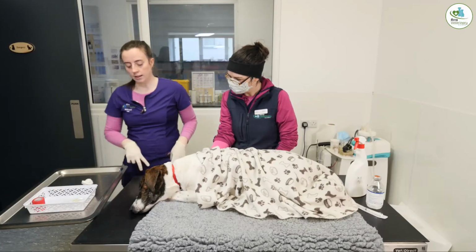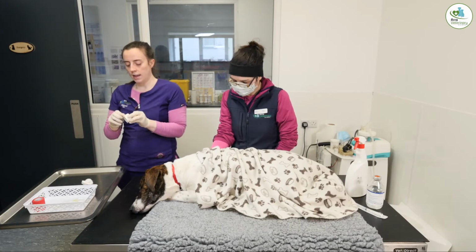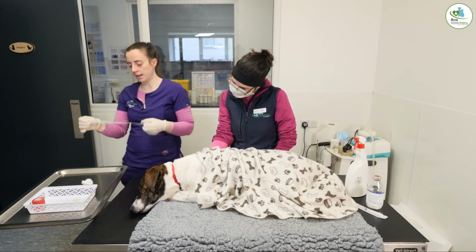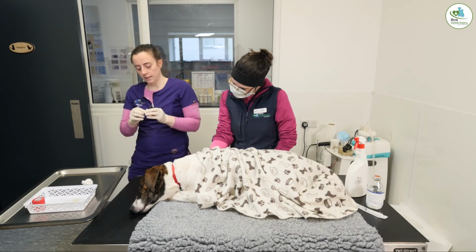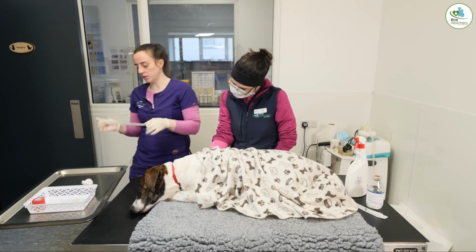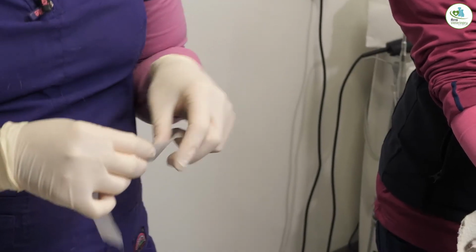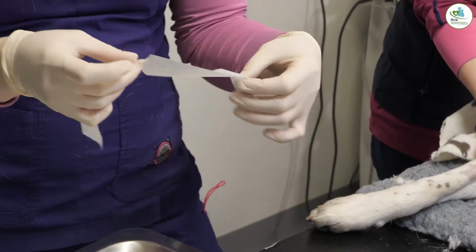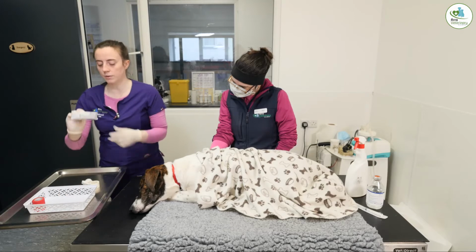Next step then that I do is our tape. So this is what's going to hold our cannula in place. So everyone has different methods with the tape. We generally do 2 strips like this and just have it ready to go. When your dog is awake and moving around, you need to have everything ready to go. I find it handy to put a little tear in that one, and I'll show you why in a minute. Perfect. So yellow cannula.